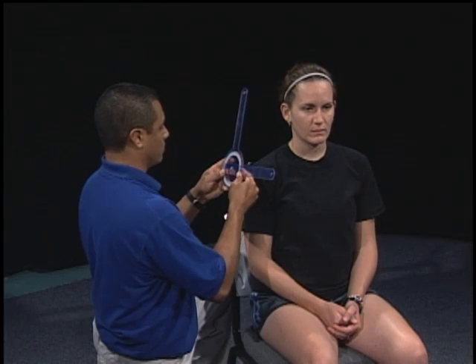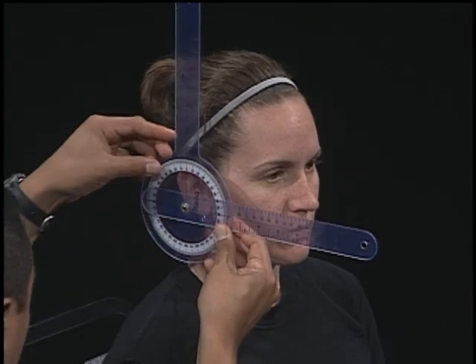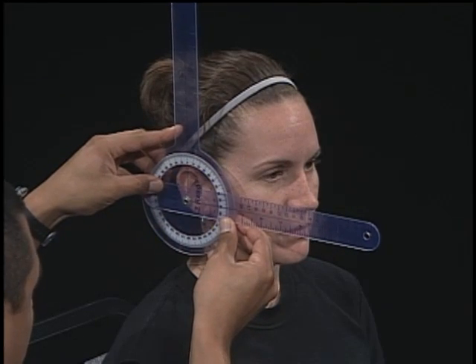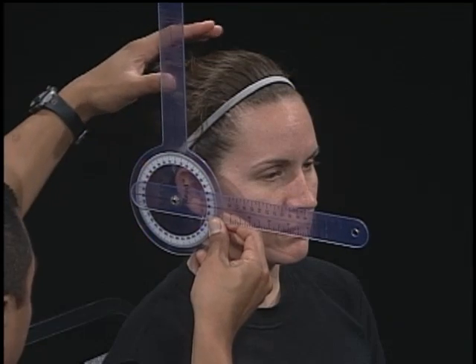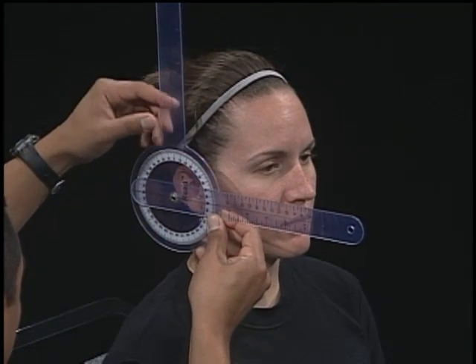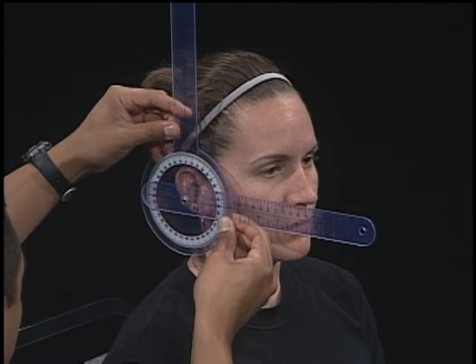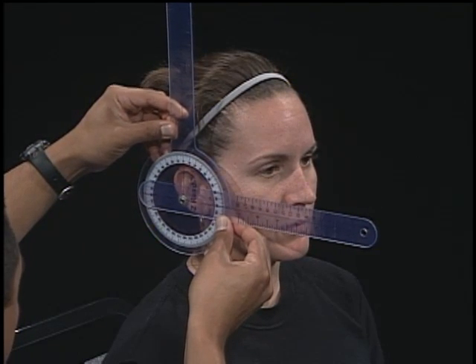Make sure you expose the bony landmarks you will be using. Align the axis of the goniometer over the external auditory meatus. Align the stationary arm so that it is either perpendicular or parallel to the ground. Align the movable arm with the base of the nares. If a tongue depressor is used, align the arm parallel to the longitudinal axis of the tongue depressor.